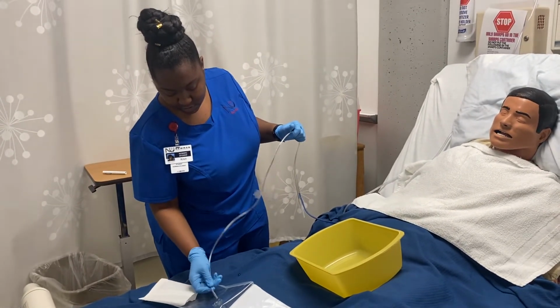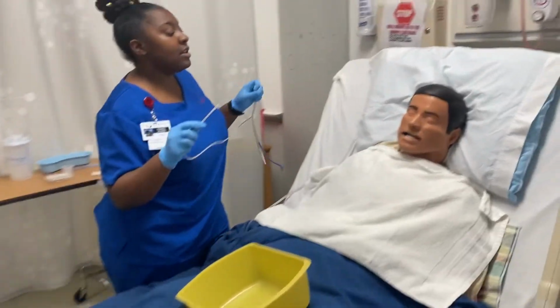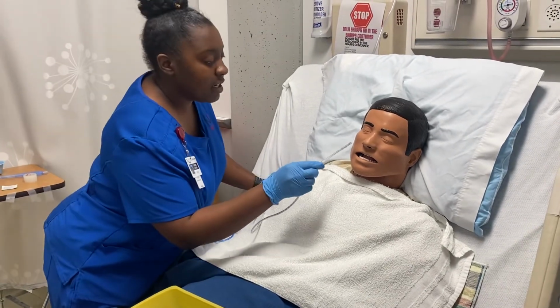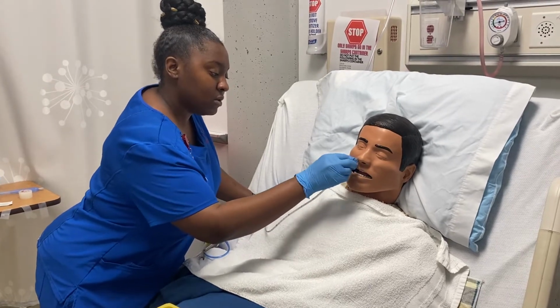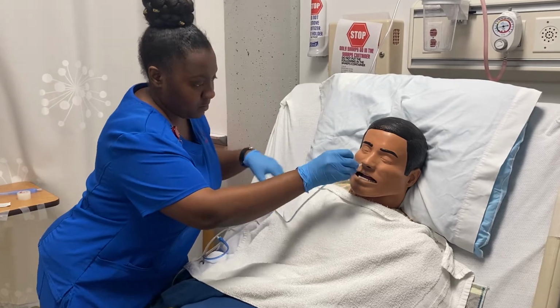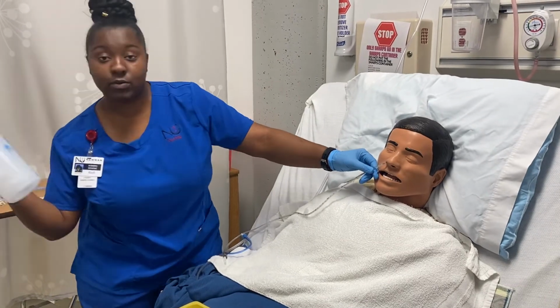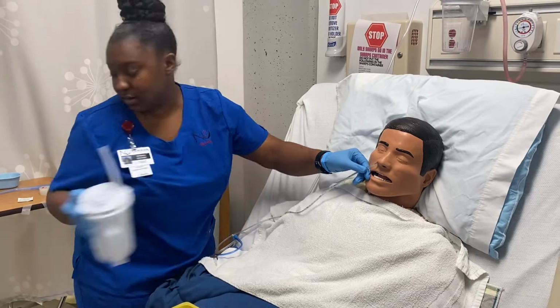Okay, and as we're doing this, you can go ahead and take deep breaths so that when it's going down, it's easier for you. Ready? Here we go. I'm also going to have the patient take a drink of water to help the NG tube go down.